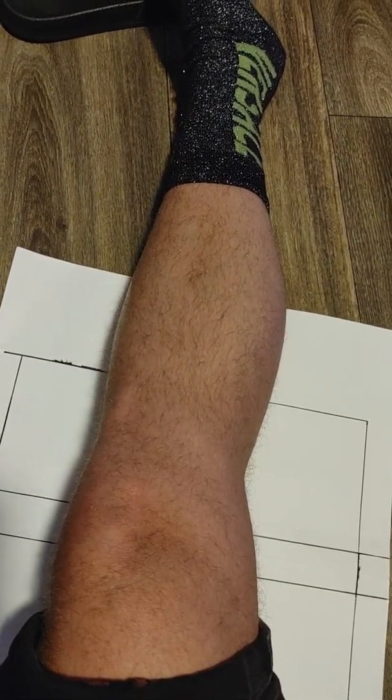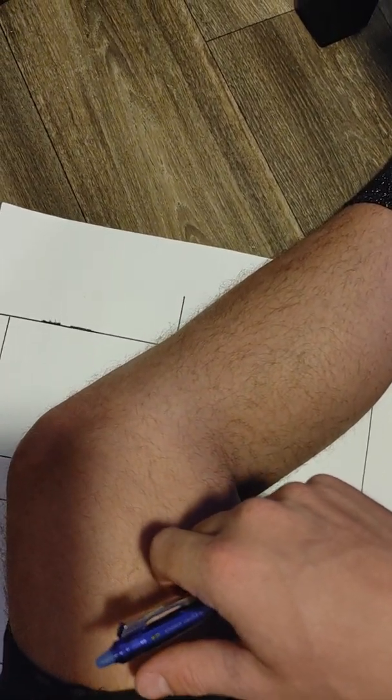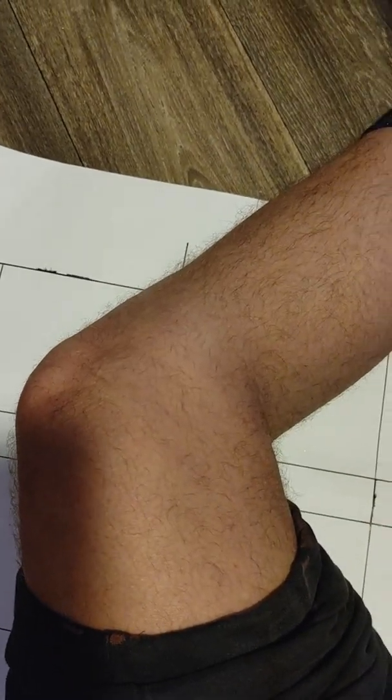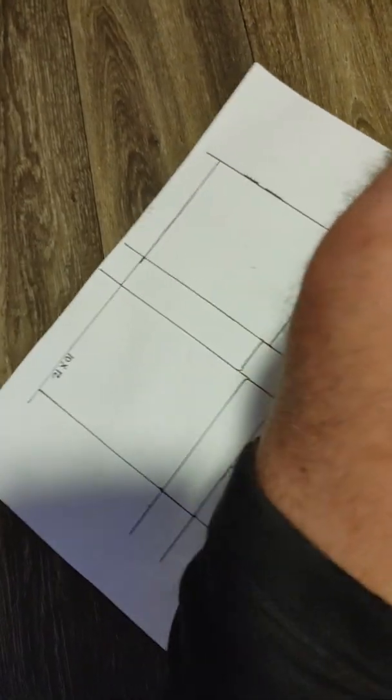Now we have a lateral view of the knee. For this, we'd be more at an angle. This one should be done standing. Imagine I'm standing, and this will be done when you flex the knee at 20 to 30 degrees. And for this one, we're going to be using the 10 by 12 film. Oh, and I forgot to mention that. We're going to be using 10 by 12 on all the knees.